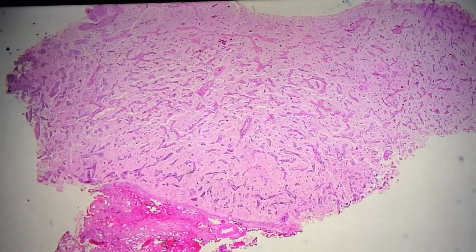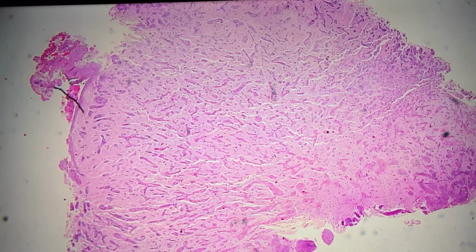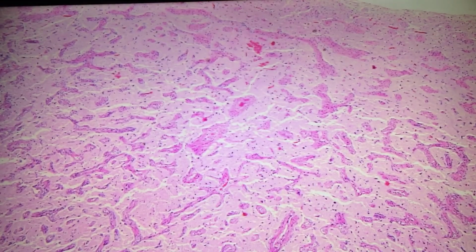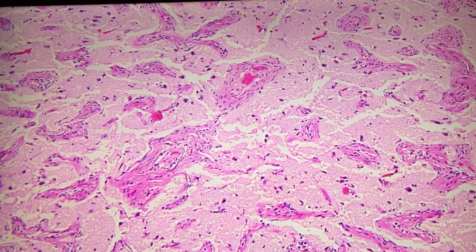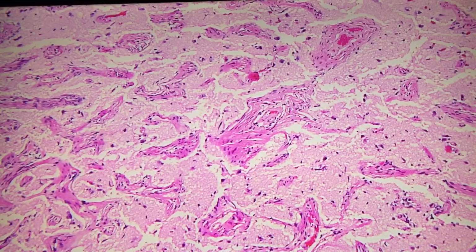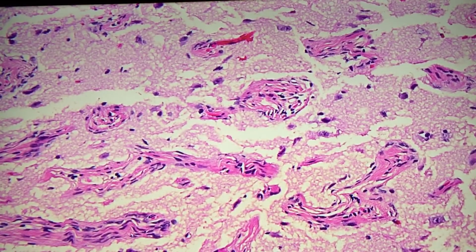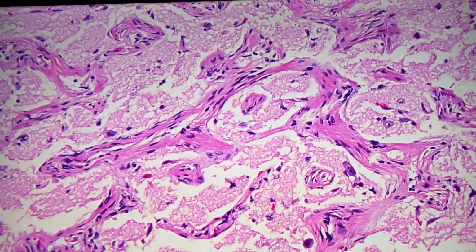Oh yeah. So here we have a tissue that doesn't have any microcysts. It has this sort of jigsaw pattern. Let me show you a little one at higher mag. It seems like they're composed of vessels, and we have this glial matrix outside the vessels. It's pretty much the same throughout, right? Is there any particular area that's different? No. I'm going to bring it to one spot and leave it there, and then we can talk about the case.